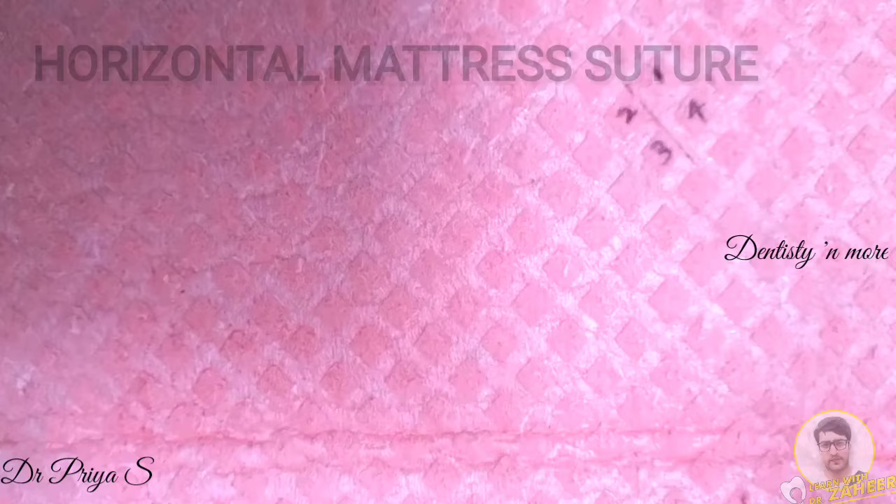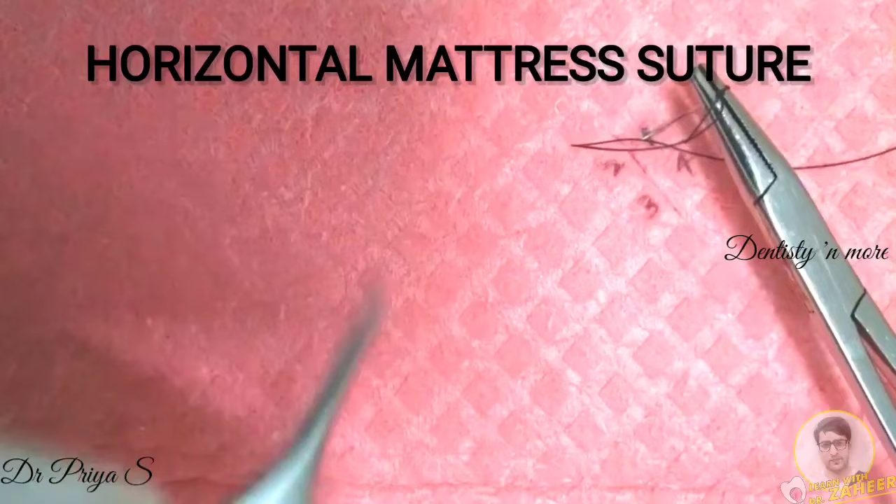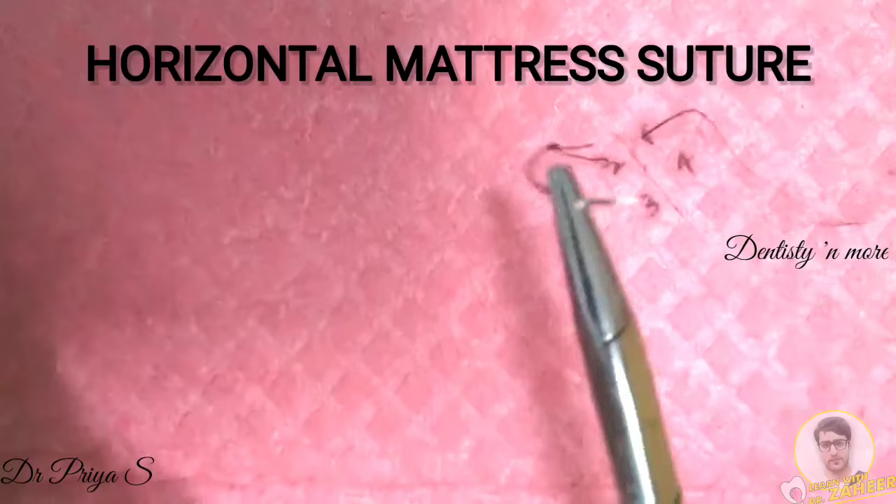The next suture technique is horizontal mattress. This type of suture may be used to close deeper layers of a wound, and it provides better eversion of skin with a less prominent scar. This is the first entry point, marked as 1, where the needle pierces the skin. The needle is passed beneath the skin and emerges out on the opposite side of the wound — so the first step is similar to that of the simple interrupted technique.